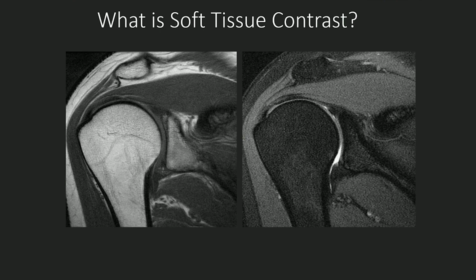Sure, that's a great question. So those are, put simply, imaging terms which correspond to anatomic planes of the body. The coronal plane is essentially equivalent to the frontal plane, or looking at the patient from the front. The sagittal plane is a lateral longitudinal plane, looking at the patient from the side. And the axial plane is equivalent to the transverse plane, or looking at the patient from the bottom of the feet and looking up towards their head.